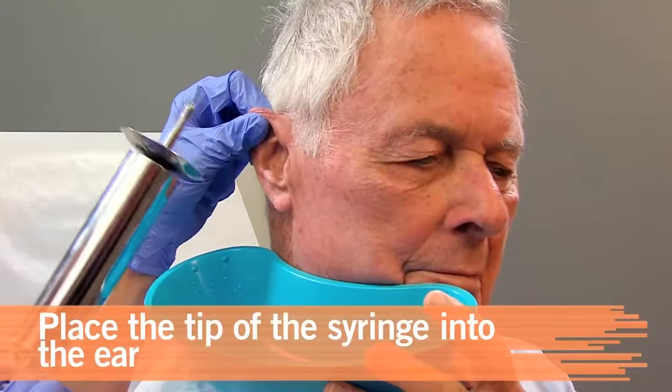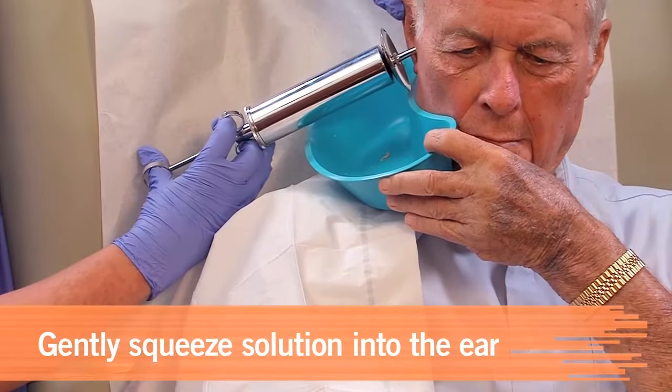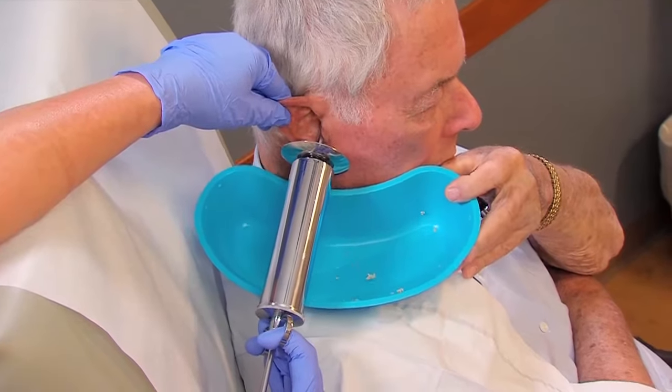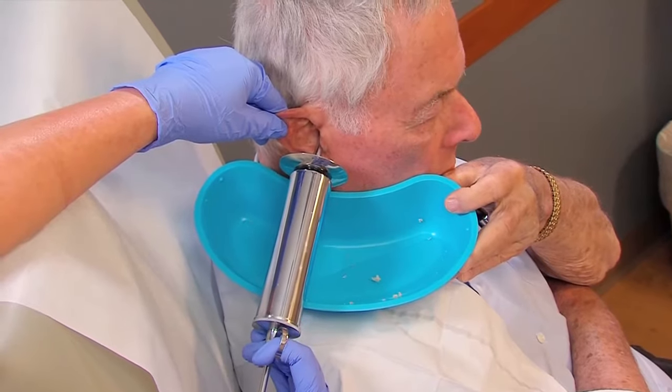Place just the tip of the syringe into the opening of the ear. Gently direct the flow of solution toward the roof of the external auditory canal. This helps protect the tympanic membrane, remove embedded material, and keep the patient comfortable.